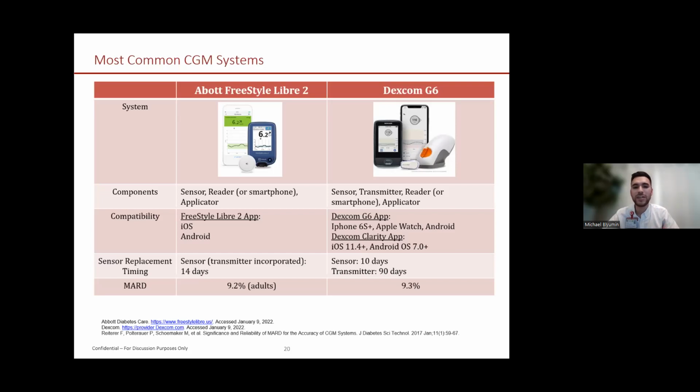With iPhone, it's really after iPhone 6S or 7 that it's compatible. With Android, there's a lot of different devices, so you always want to check. But with most new Android devices, they are compatible.